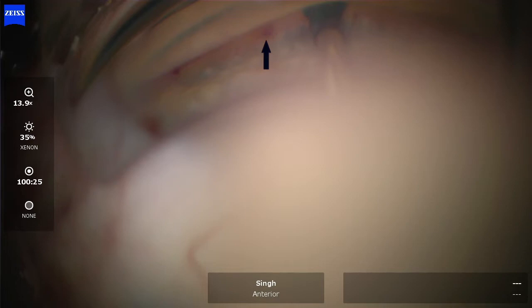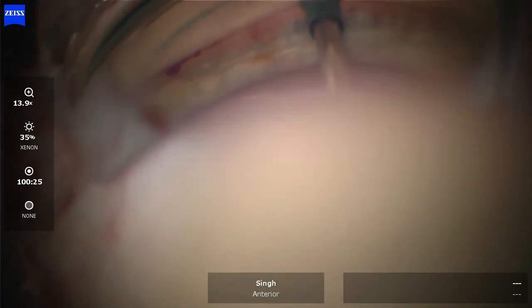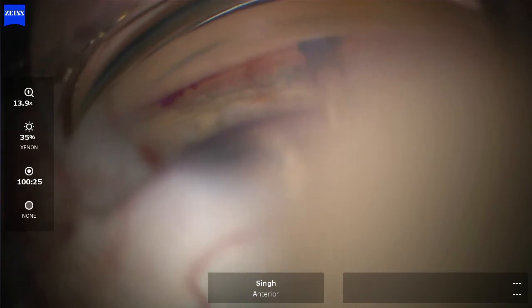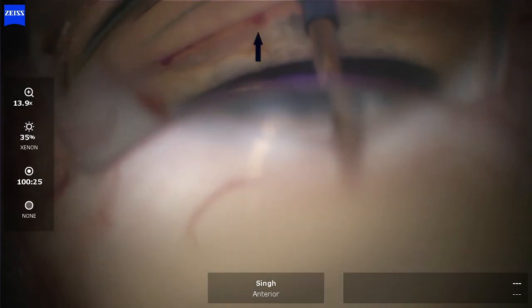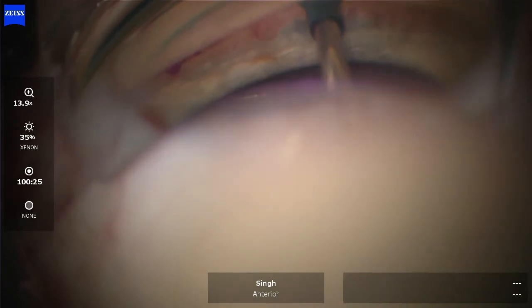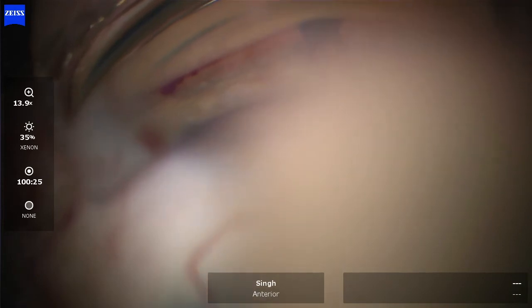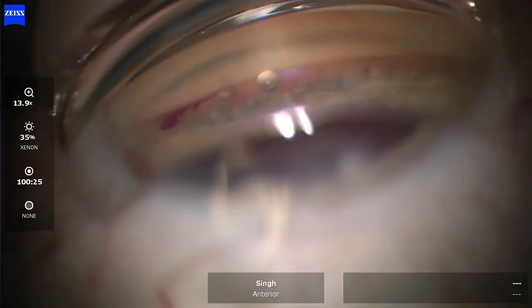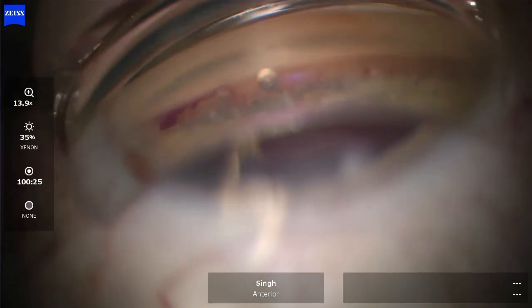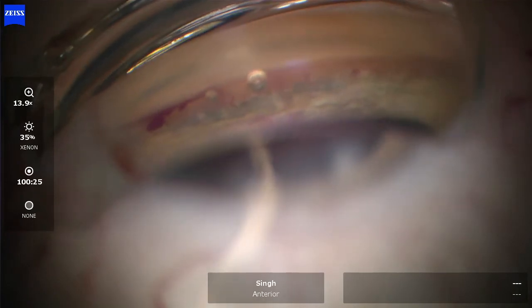Look at that black arrow — watch that plume of heme as I press just about a clock hour away. Here in slow motion you can see the viscoelastic going through the canal and coming out of that microgoniotomy. This is evidence of significant force entering the canal with each press of that lever. Based on the movement of that heme, it is clearly coming out of the goniotomy and not from the anterior chamber.